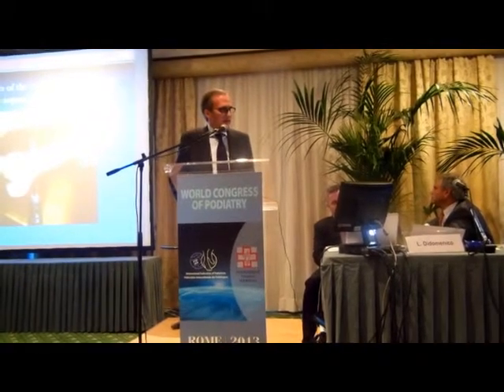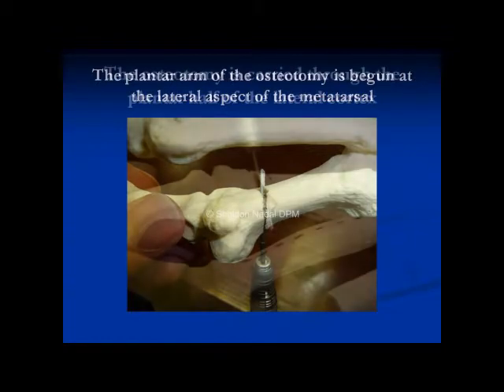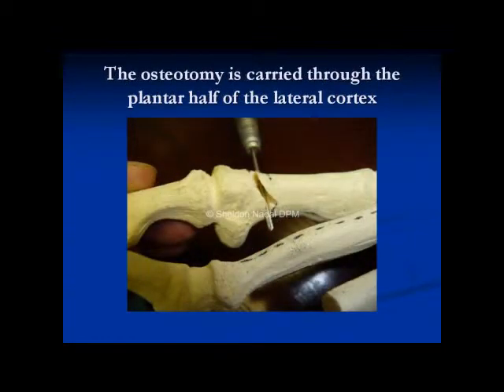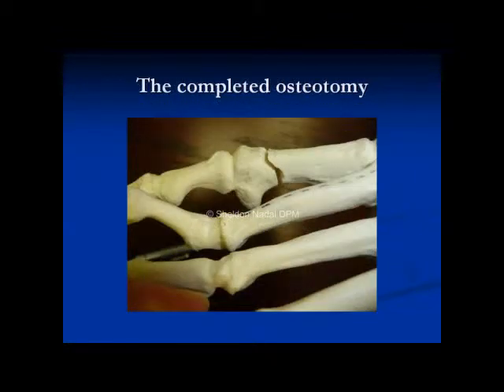So then we go back with another burr, a third burr, into the original fail-safe hole or pilot hole, and we're going to cut the plantar surface. And you can see these are the sesamoids. And so we start cutting. Again, we're pivoting from the original osteotomy site. We're cutting the inferior lateral cortex and then cutting from lateral to medial, cutting through the plantar cortex, and then finally through the medial inferior cortex, to complete the osteotomy. And there's the completed osteotomy.